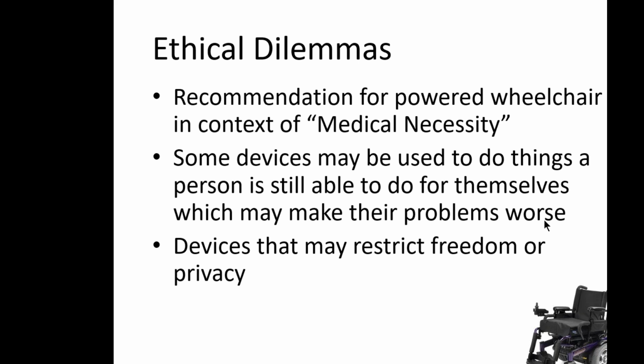Okay, poor and declining cognition. Yeah, here's if an individual can use a wheelchair without any difficulty and their medical condition isn't progressive. Yep, still if they're checking to see if they can still use a manual wheelchair, and then the patient doesn't have the cognitive capacity to safely operate a wheelchair. So yes, those are all good ones.